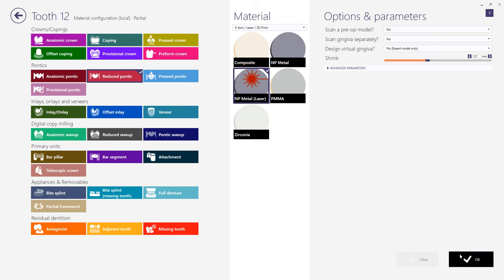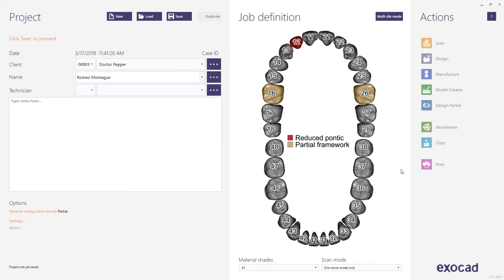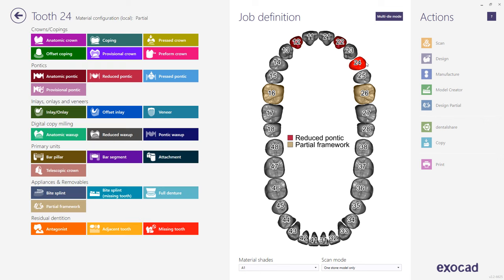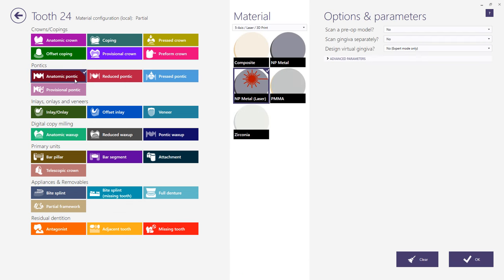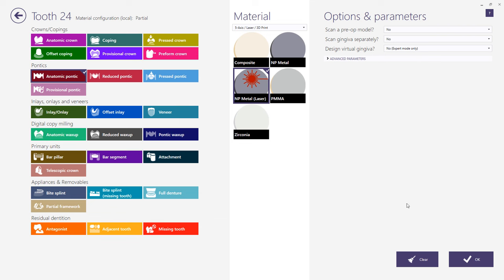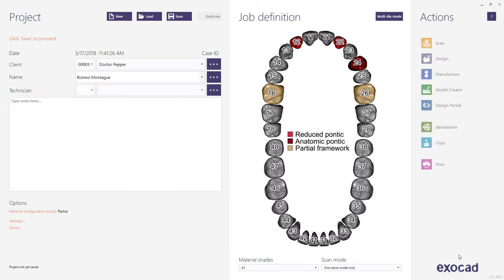Again, use the hotkey Control to duplicate the restoration type. For a metal dummy, choose Anatomic Pontic. Other restoration types can be chosen here as well. For example, if you are making a partial with telescopic crowns, you would choose Coping. Next, click the Save button.